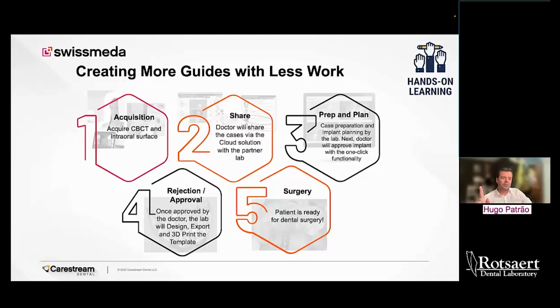So the first step is to acquire good data. Good CBCT, good intraoral scan. Then you just need, as a doctor, to share or upload that information into a portal, into a cloud solution. It takes no more than 5 minutes, and I will show you how to do it.